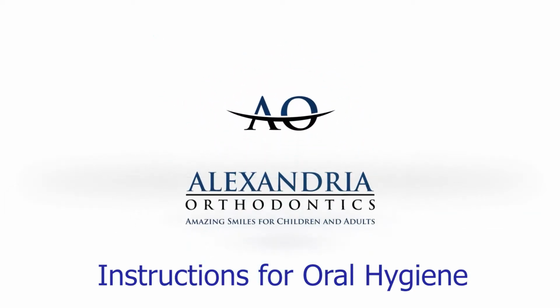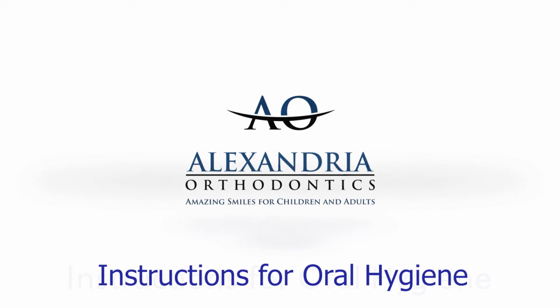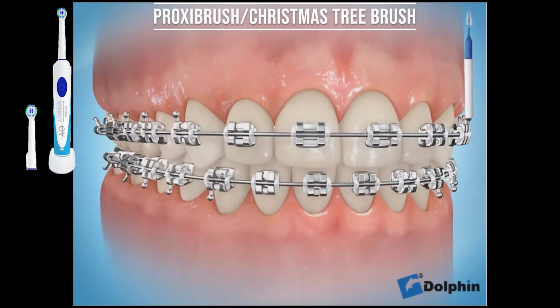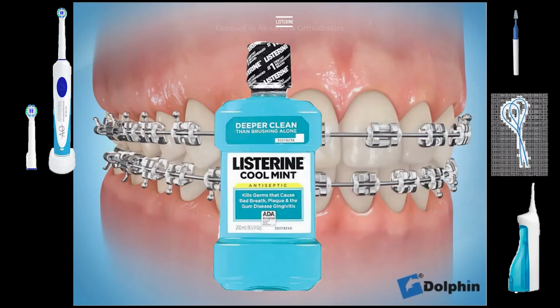Congratulations, you had your braces placed today. We will be going over some very important instruments in keeping your teeth and these braces very clean. Remember, in addition to knowing and having the instruments, it's also important to know the techniques and dedicate the time for proper oral hygiene. The instruments we will be going over are the toothbrush, the proxibrush, water flossers, floss threaders or super floss, and Listerine.